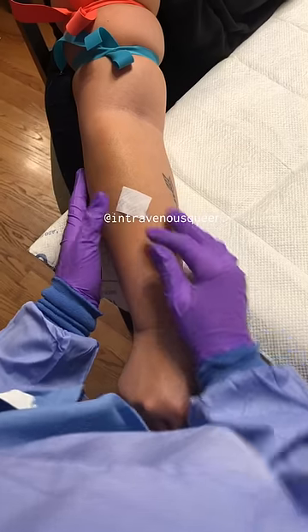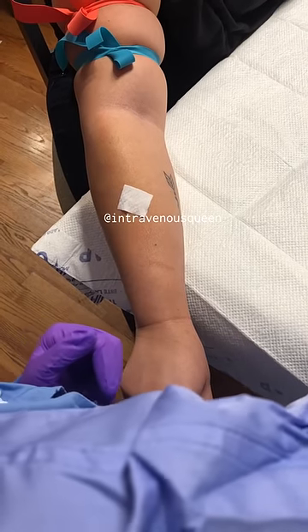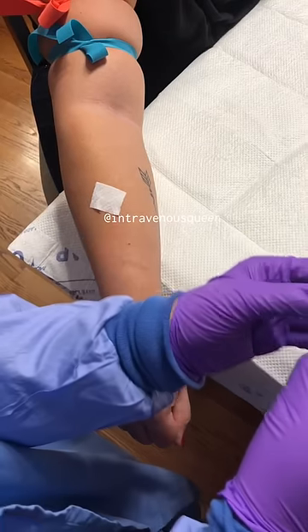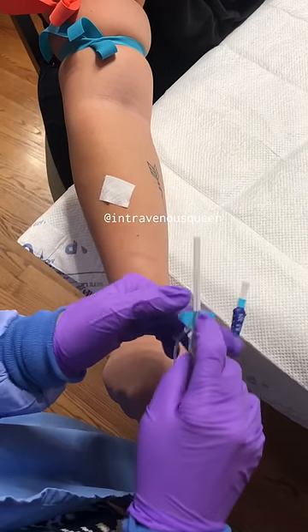My personal preference is alcohol pads, and this is also a really great trick — use the corner of the alcohol pad pointing directly to where you want to go.